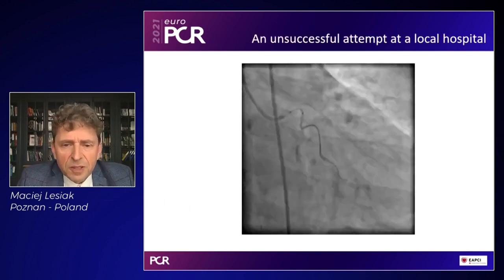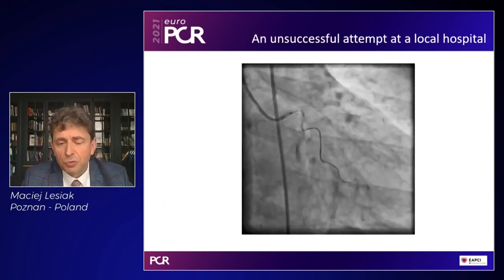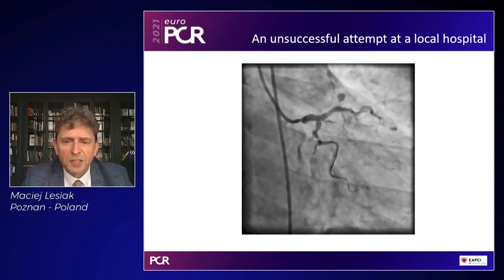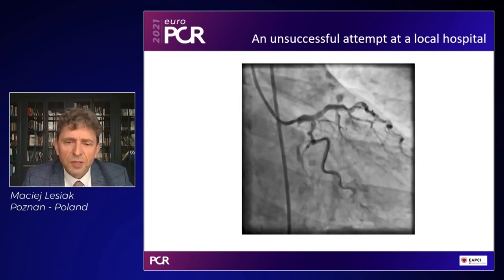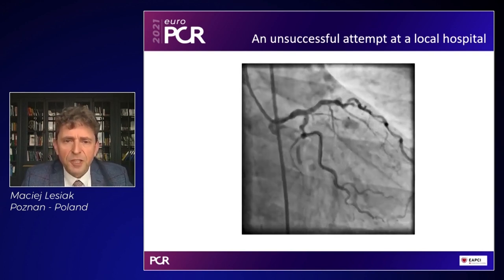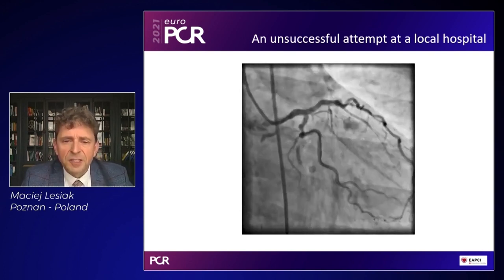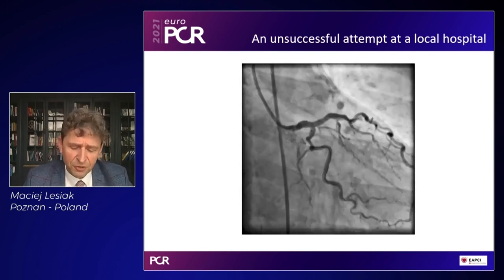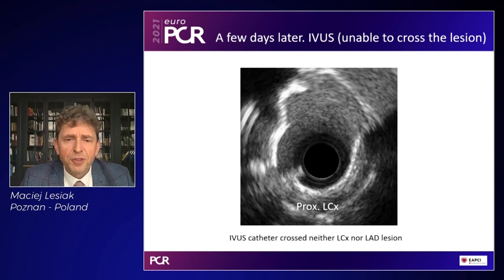The operator in this local hospital attempted to fix it, but he failed. You see that he was not able to deliver even a small balloon over the buddy wires. So he used a buddy wire technique, and it was unsuccessful. So the patient was referred to my hospital, and a few days later, we did the procedure.